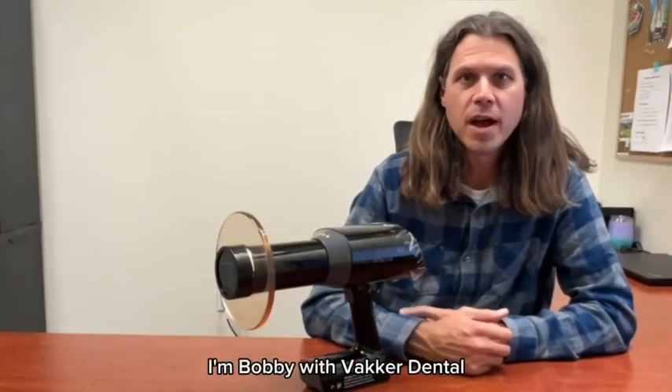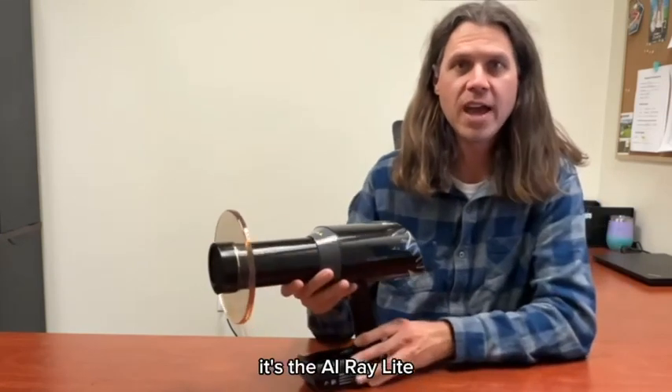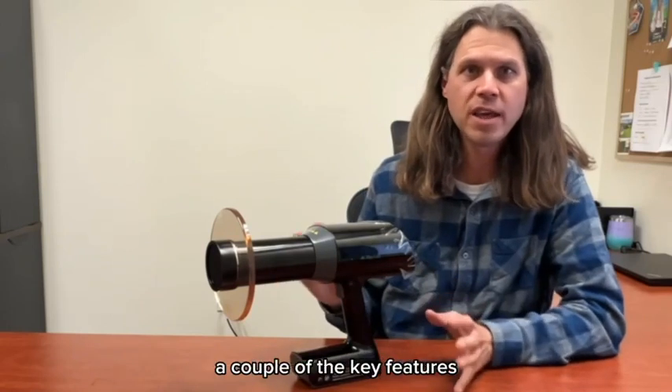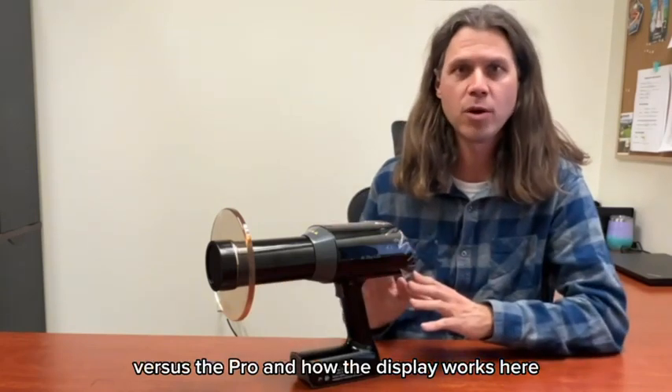Hi, thanks for joining me. I'm Bobby with Backer Dental and today I'm really excited to go over one of our new units here. It's the AI Ray Lite. I just wanted to mention a couple of the key features really quick before we dive into the weight versus the Pro and how the display works here.